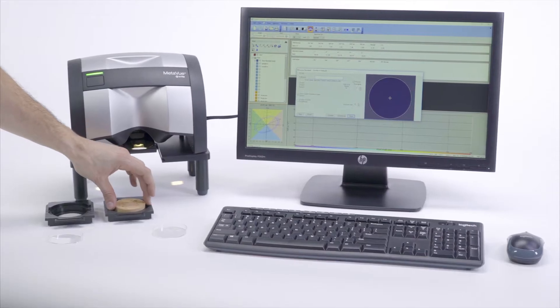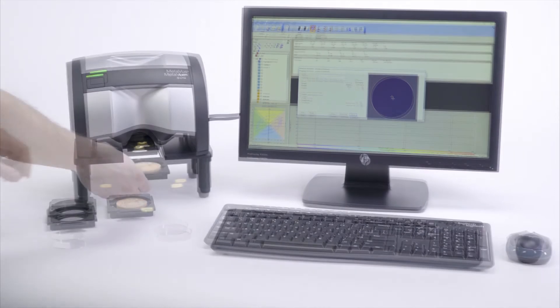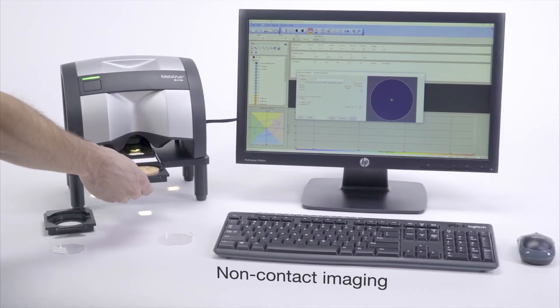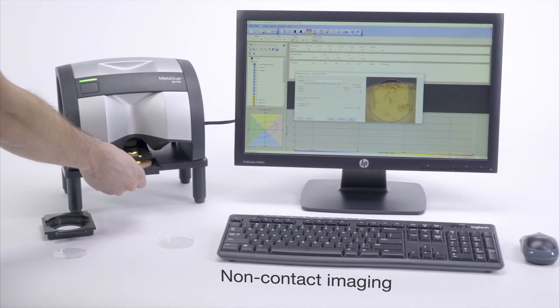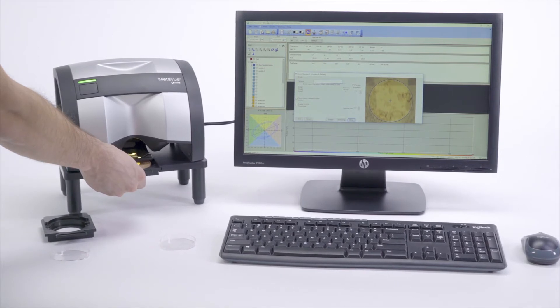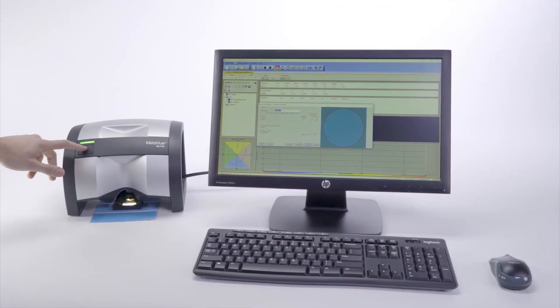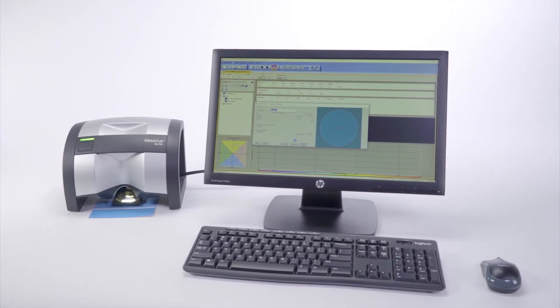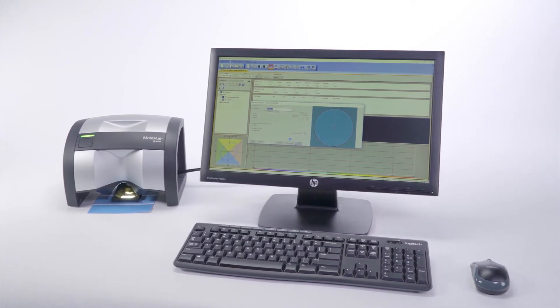It is the first device of its kind, featuring innovative non-contact imaging technology and a convenient measurement button on the machine. This lets you initiate measurements from both the software and the device itself for maximum flexibility.